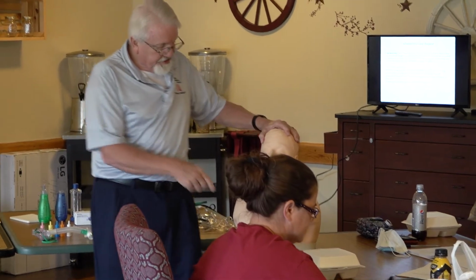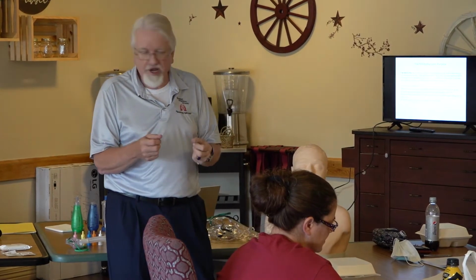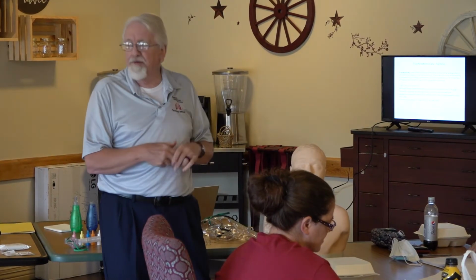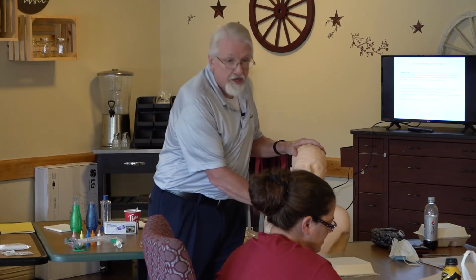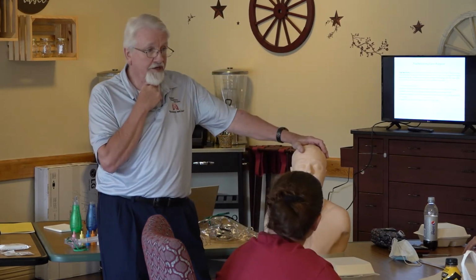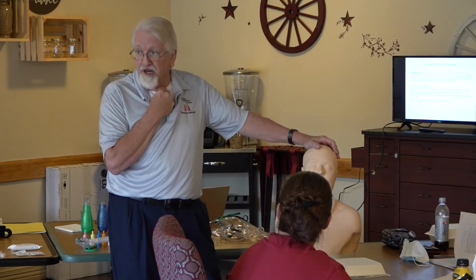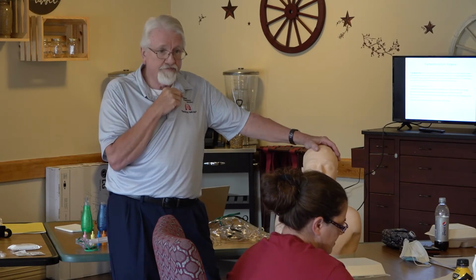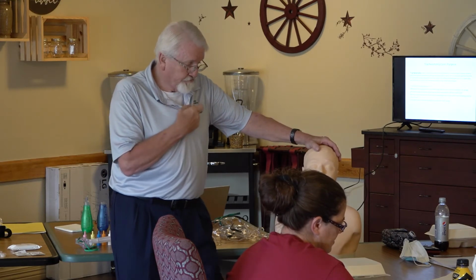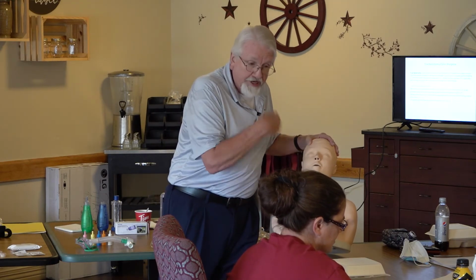Okay, like I say, with the ones with elastic, it's a little bit more challenging, but you don't want any more than that, because if you do, this can work out and get into a pocket. It doesn't necessarily have to come all the way out. It can just come out of the airway and lodge over to the side there, and then they wouldn't be getting their oxygen.